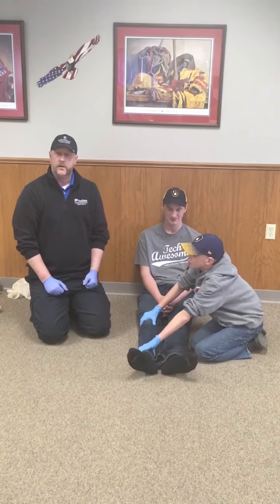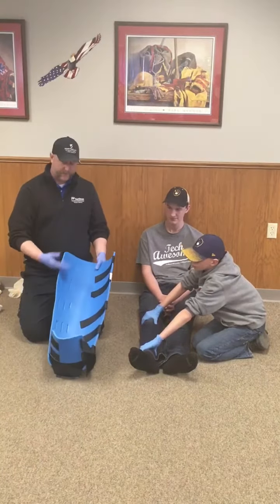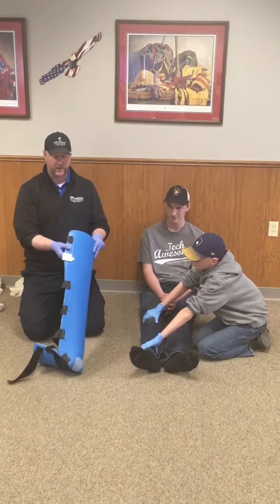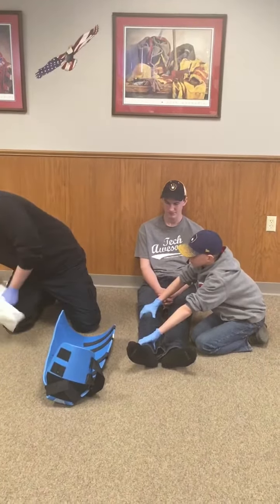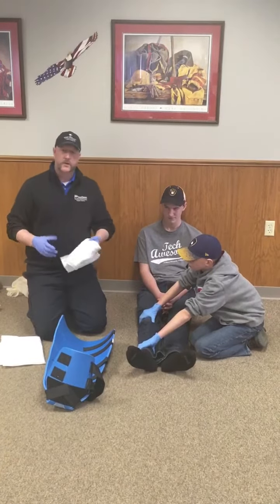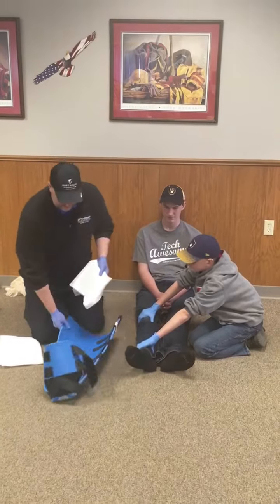For this video I'm going to use the pro splint — the blue foam splints with the velcro straps. Anytime I use a pro splint, I want to make sure that I add padding, which helps add a little more comfort to the leg injury.